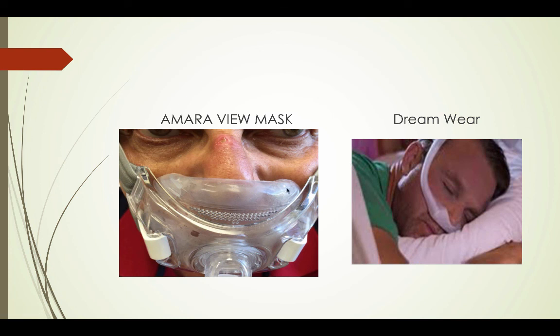And there are some very good designs that have come out which have a minimal imprint on the face, and the patient does not feel claustrophobic. They do not rest on the nasal bridge. In this case you can see there is a nasal bridge ulcer, and you cannot use a traditional mask which rests on the nasal bridge, but this new design allows use of an oronasal mask without affecting the ulcer outcome. So definitely you can make use of these innovative designs to treat your OSA patients.